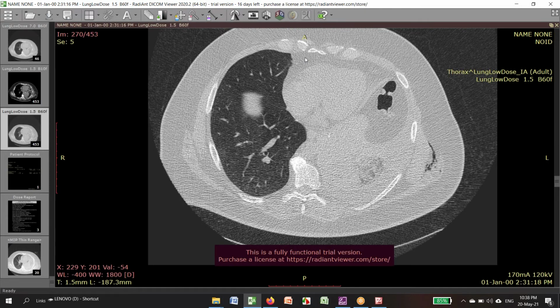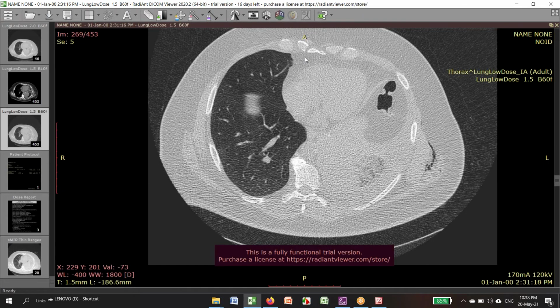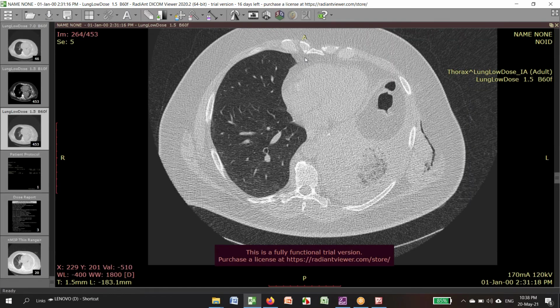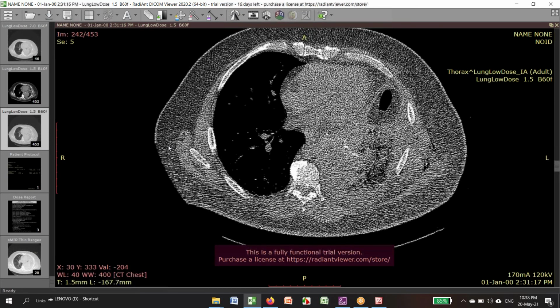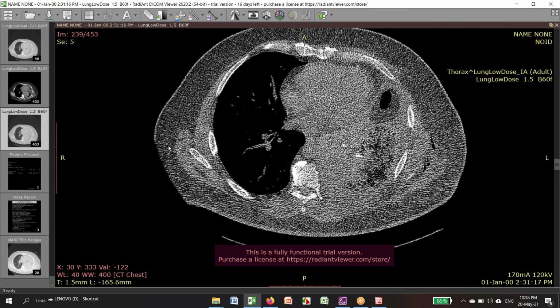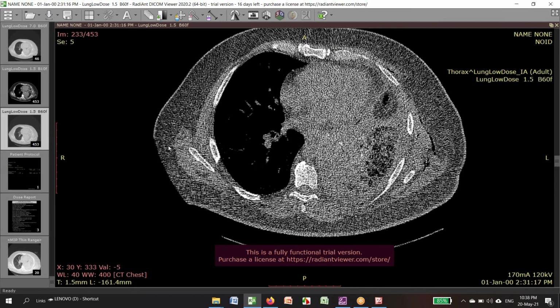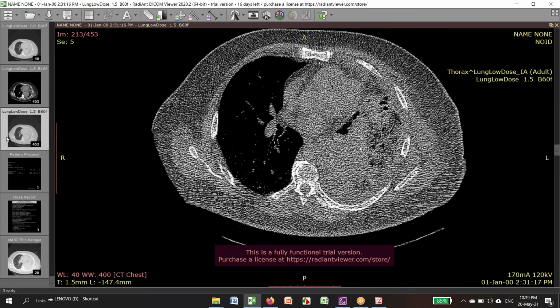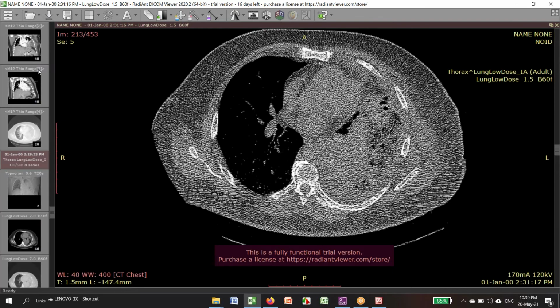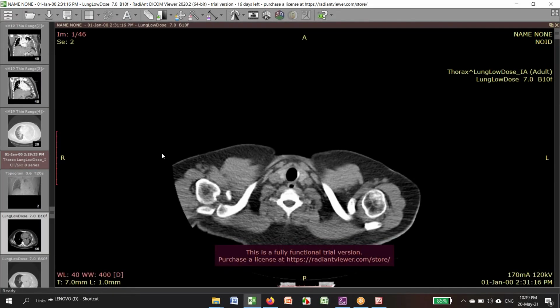Unfortunately, the CT was already ordered by the internists, and so it was a non-contrast CT. But even in this, it's high resolution, so the imaging is a bit sharp, I think that even in the mediastinal window, we see an appearance that fits with the bird's nest sign. Let me see if we have a softer window. Yep.